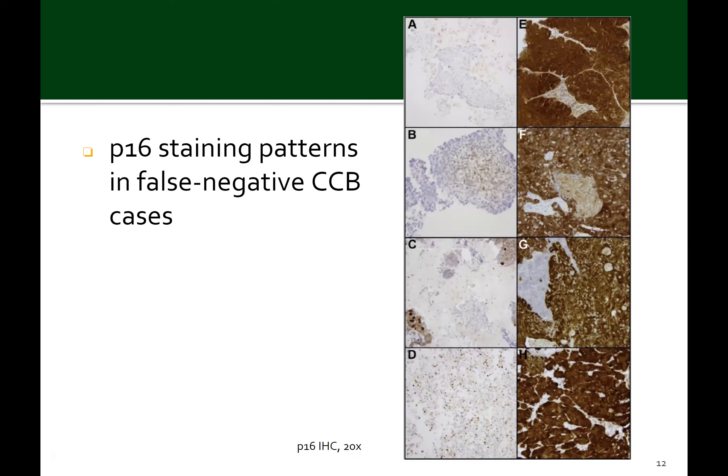Next, looking at the P16 patterns in the false negative cytolite cell block cases — nearly half of the P16 cytolite cell blocks were false negative. They showed 0 to 10% nuclear staining, as in panels A and D, and 0 to 65% cytoplasmic staining, as in panels A and C. Panel B illustrates weak intensity staining, while panels C and D show stronger intensity. Panel D also highlights what was sometimes seen: isolated tumor cells without any intact tissue fragments. The subsequent surgical material, shown in the right panels, is clearly P16 positive.